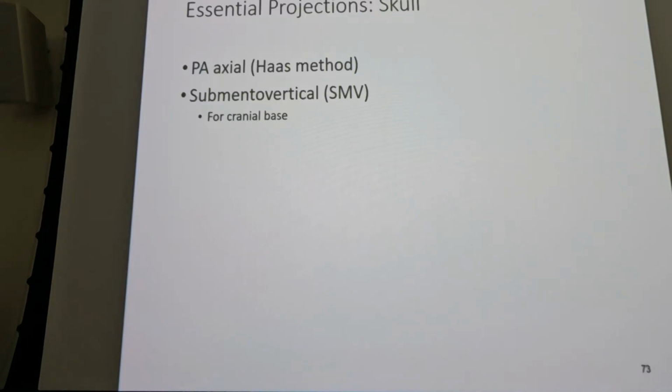Nasal bones, what's the position there? Lateral, right. So flip over to page 85. Was the position at the top safe? Temporomandibular articulation, TMJs, right, so was the body position there? Lateral. Same thing on page 86, also same thing on page 92 for sinuses.